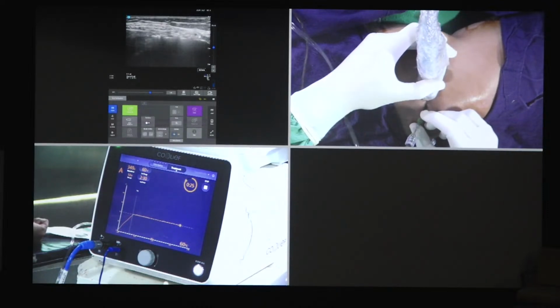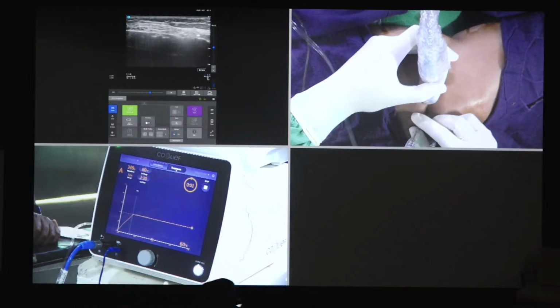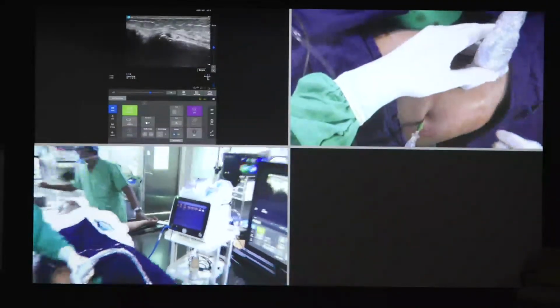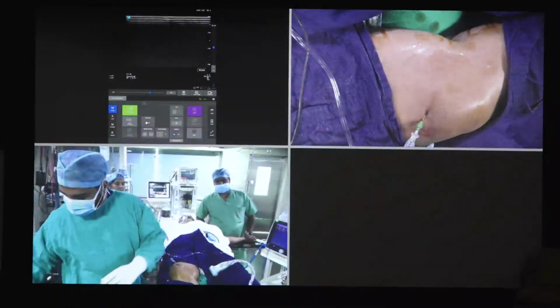Even if the patient is having posterior knee pain, this is not going to help. So we need to do maybe an IPACK block, or we cannot do RF there because of neurovascular structures, but maybe we can do chemical neurolysis. There are studies or papers where they do phenol neurolysis for the posterior capsule. So we have done the superomedial, and then we go for the inferomedial. I'm just going to remove the needle and the cannula.